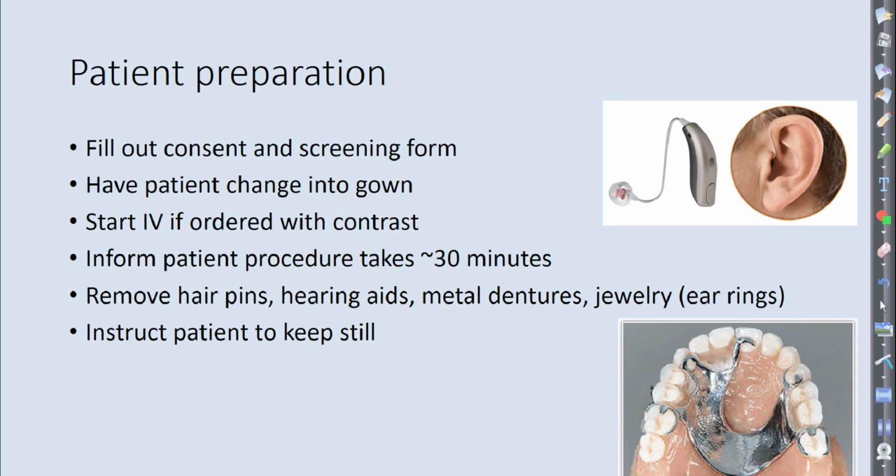All right, prep is the same, so I'm not really going to go over this. So fill out the consent form. Most of these are going to be with contrast. The MRA head usually is without contrast. We use a time of flight pulse sequence, which saturates our stationary tissue, the tissue that doesn't move, so that the inflowing blood has high signal. So that one, most of the time, does not need contrast. But you can enhance the vessels a little bit more by injecting contrast.